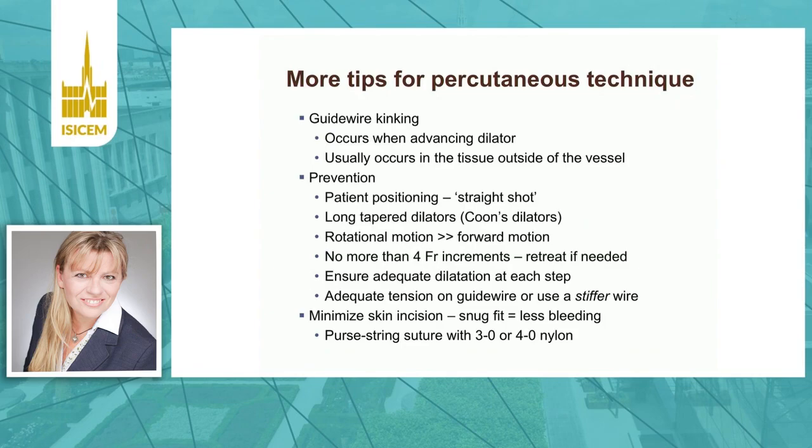Some more tips for the percutaneous technique is to avoid guide wire kinking. It occurs, for example, when advancing the dilator, and if the dilator is in the tissue outside of the vessel, there is also the danger of vessel perforation. To prevent this situation, patient positioning is important.